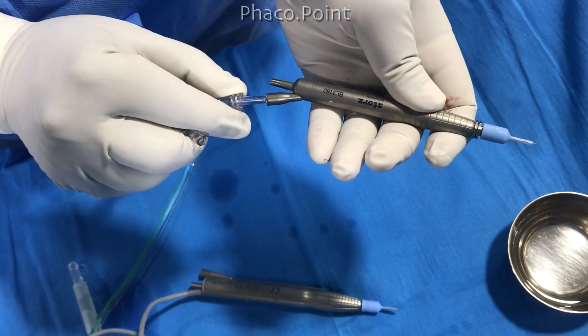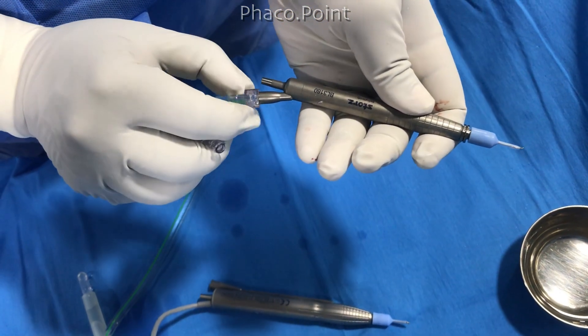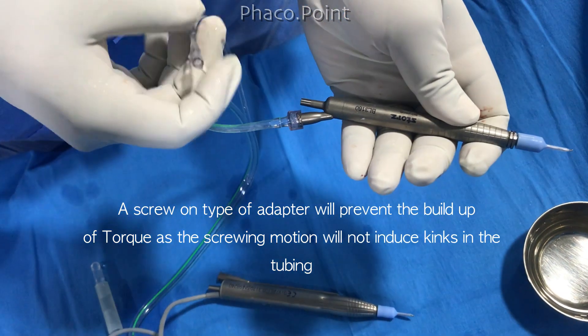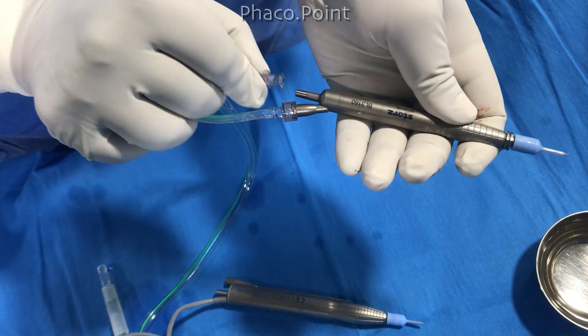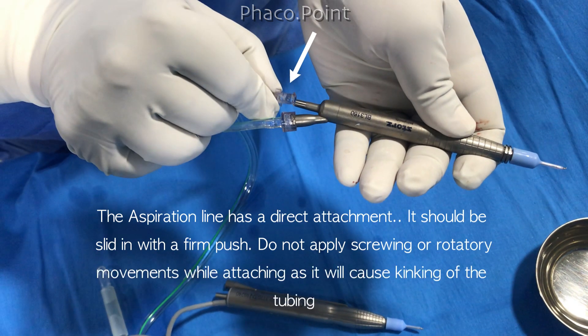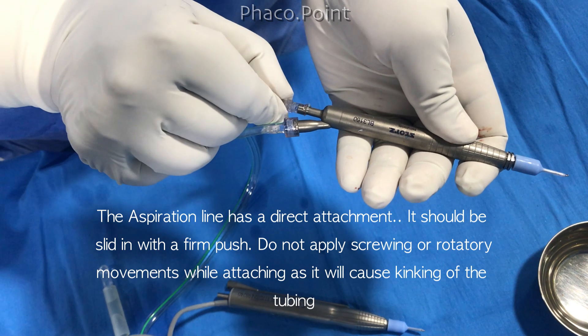The irrigation line has a screw-type adapter. This screw-type adapter will prevent the buildup of torque, as the screwing motion will not induce any kink in the irrigation tubing. However, the aspiration line has a direct attachment — it should be slid in with a firm push. Do not apply screwing or rotatory movements while attaching this, as it will cause kinking of the tubing.